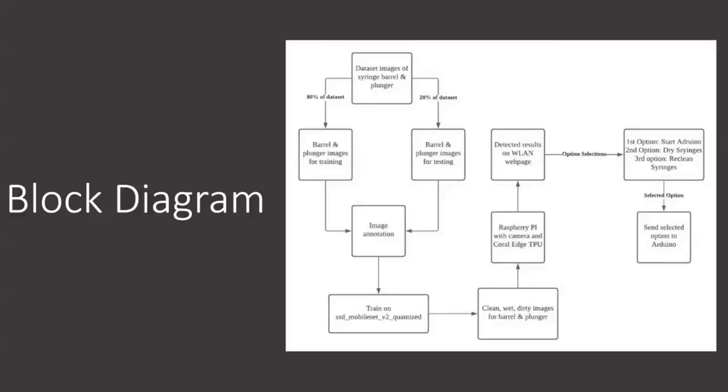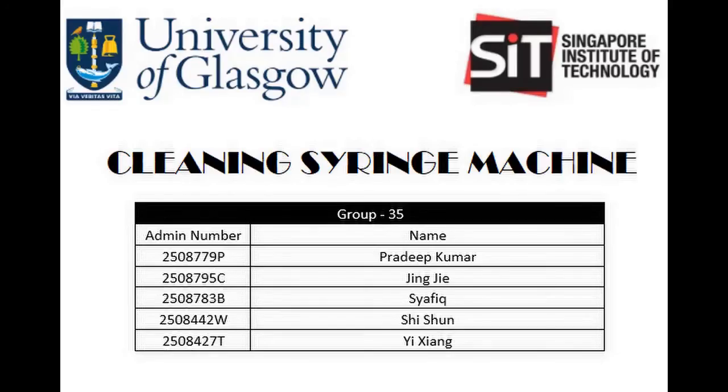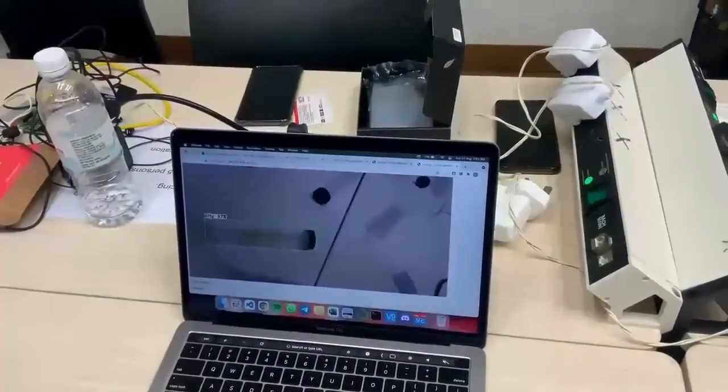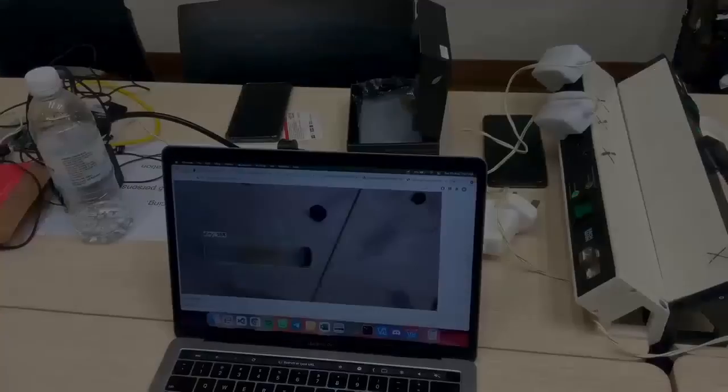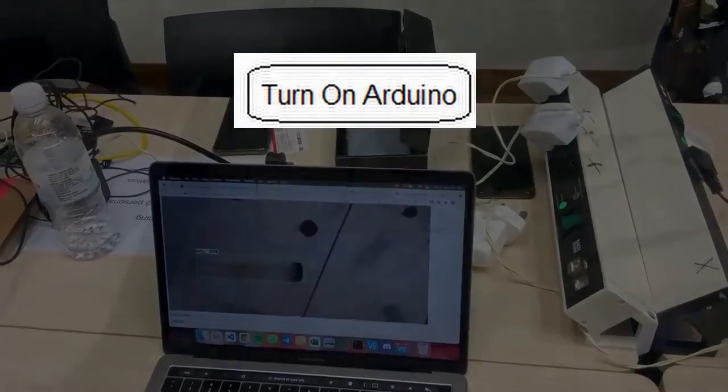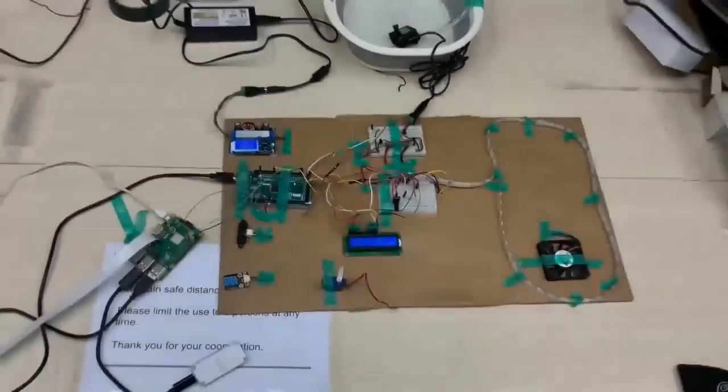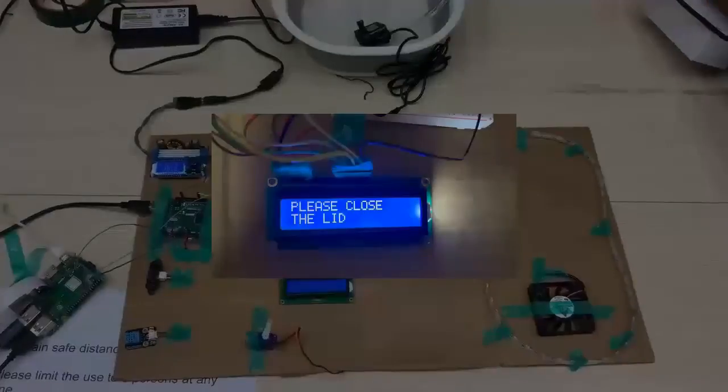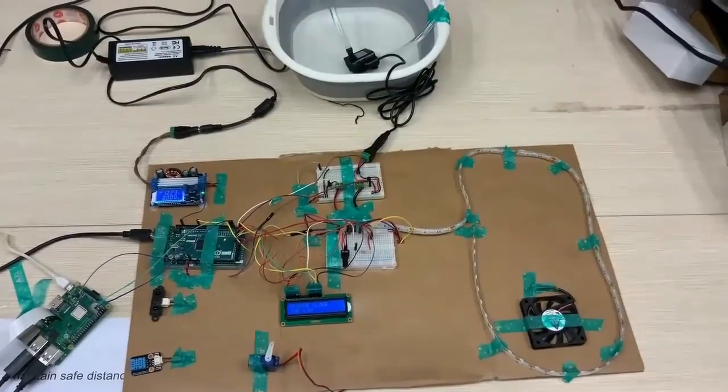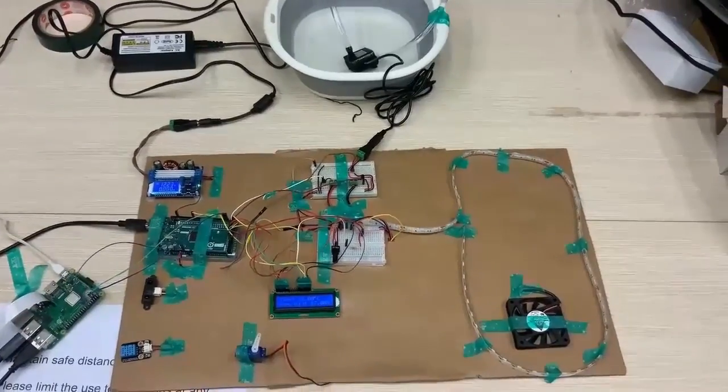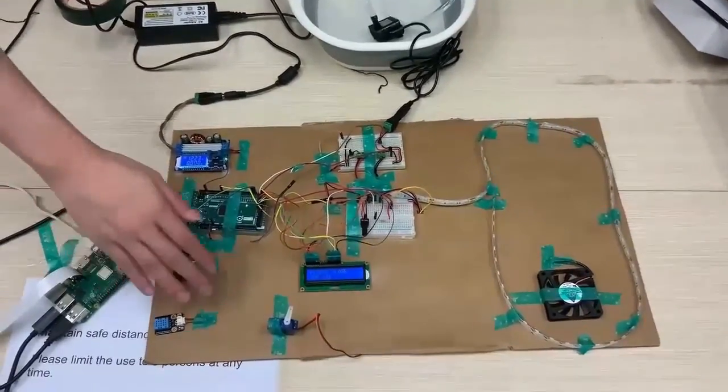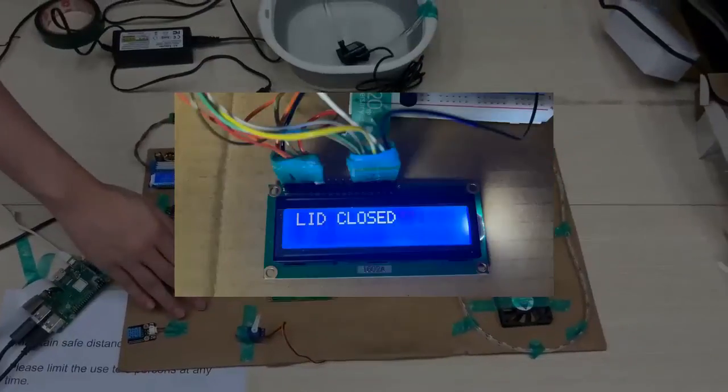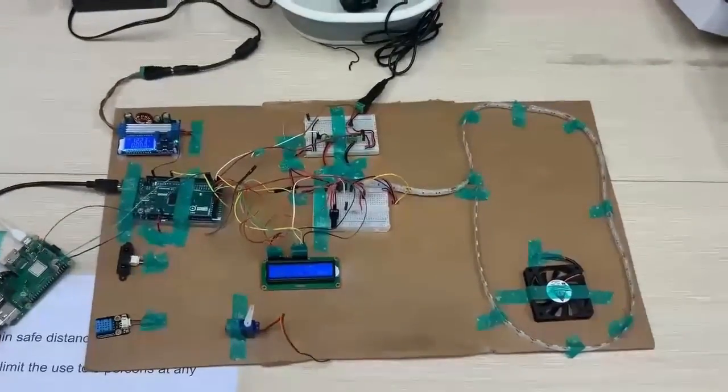This concludes our presentation. We will now move on to how our product works. This is the user interface. In the user interface, the nurses will have three options to pick from. The main one being to start the device. When the device is turned on, there will be a message then to close the lid. This is to ensure the device is closed before the machine is turned on. When the lid is closed, which will be picked up by the infrared sensor, there will be a lid closed message sent. Afterwards, the process will begin.